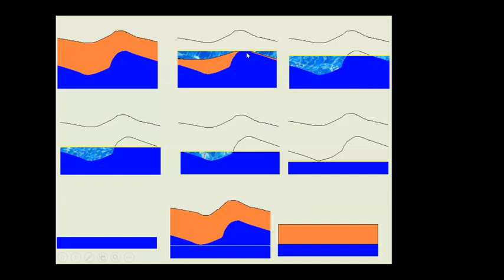You will reach the tip, here, the black window. Is that clear on the monitor? You will notice also that the epithelium here is being reduced because the epithelial ablation rate is higher than the stroma. So it will eat some of the epithelium while it is just touching the stroma. If you continue, you will reach here much faster than you induce the change. That's why you have to put the thick fluid to make a new layer, and then you apply the laser on the thick fluid. Once it goes out, you add more until you get a smooth surface. By that, the new epithelium will go up and will be okay.